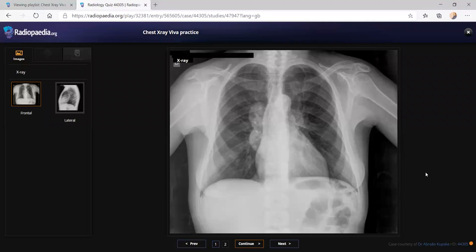Okay, so I'm reviewing the X-ray. There might be some soft tissue density in the bilateral axillary region. The bones look osteopenic. I feel that there is also a lobulated lesion along the left paravertebral region, which would make it more likely extramedullary hematopoiesis, and I would take the history of anemia, like thalassemia, etc.